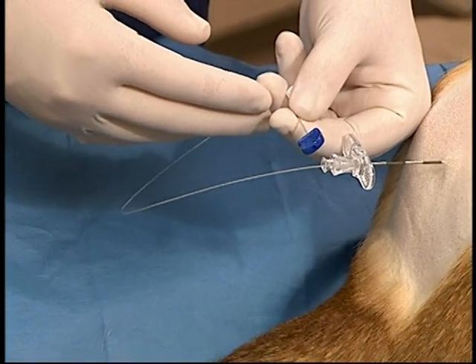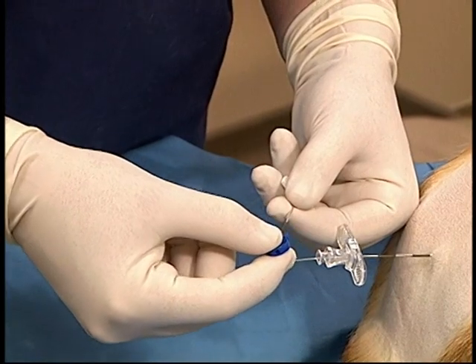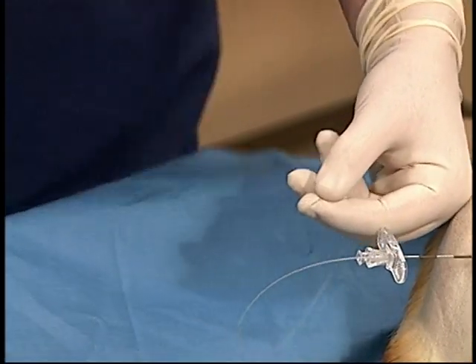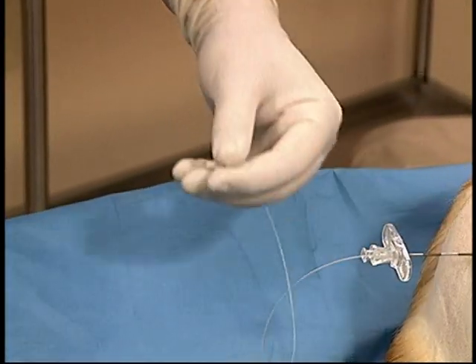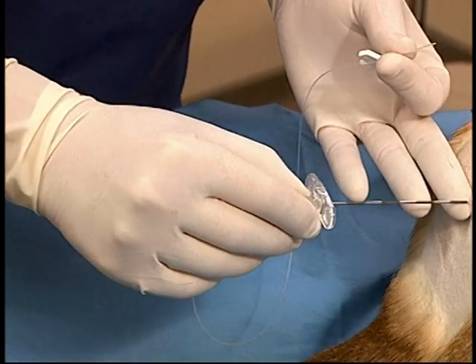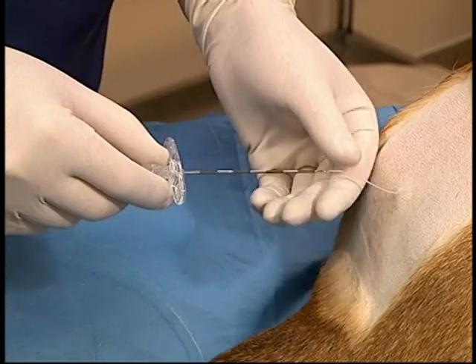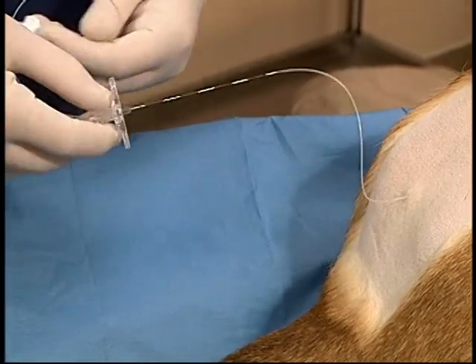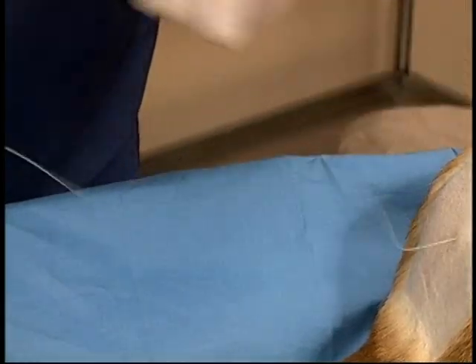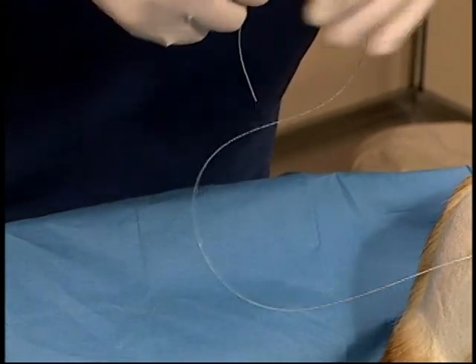Once the catheter has been placed at the desired location, the inner wire stylet is gently removed, and then the TUI needle is also removed. The catheter is stabilized gently at the skin entry site during this process or at the end of the hub of the needle. The catheter is left long if it will be used for anesthesia, and if only being used for analgesia, the catheter can be cut shorter at this point in time.